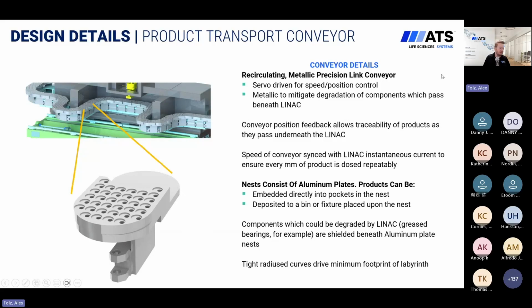Moving on from the linac, we'll move into the product transport conveyor here. Before I get too deep into the technical details, I did have a colleague of mine who described the conveyor best, I think. If this resonates with you, depending upon if you've been to the style of restaurant, he described it as an industrial version of a dim sum or rotary sushi conveyor. And I think that was a very apt comparison, right? If you've ever been to that style of restaurant.